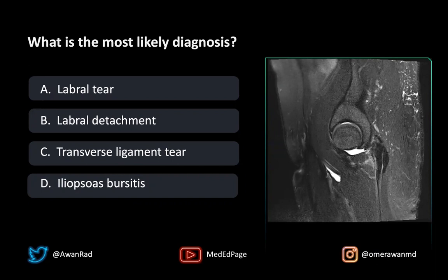First of all, it's important to understand that this is an arthrogram, so all this high signal fluid is actually contrast that we've injected into the joint space. There is some fluid here around the iliopsoas muscle, maybe the iliopsoas bursa, but that's iatrogenic — that's from our actual injection. The main finding here is increased signal along the anterior superior labrum, which suggests a labral tear.